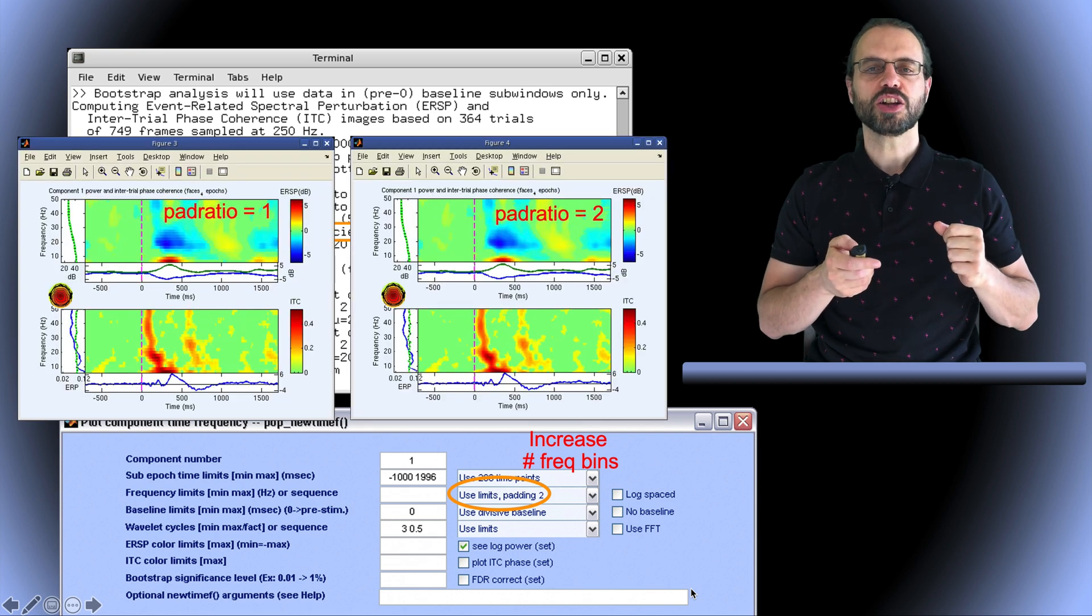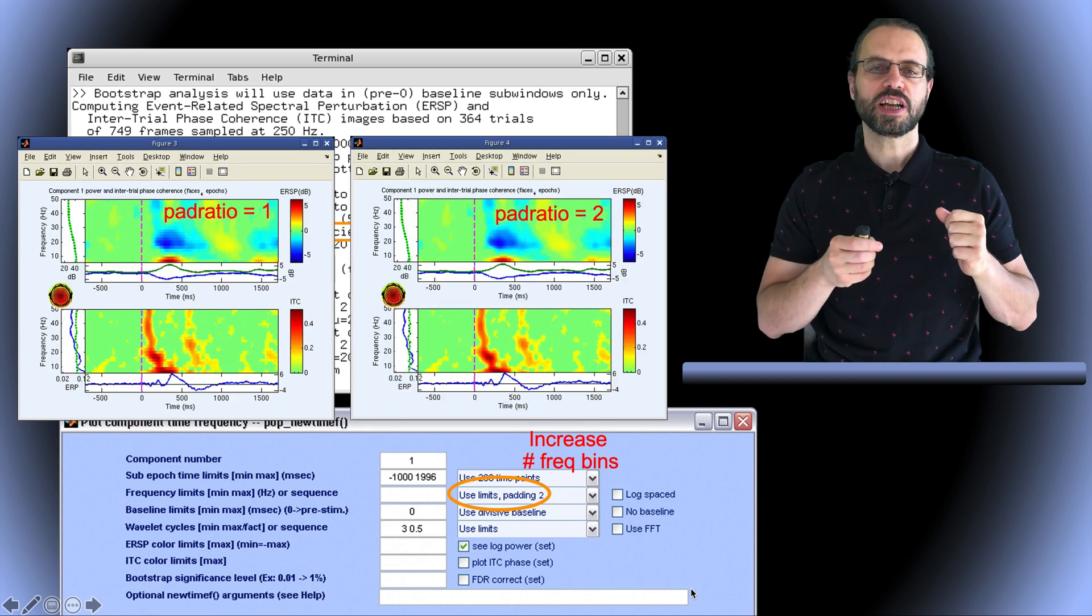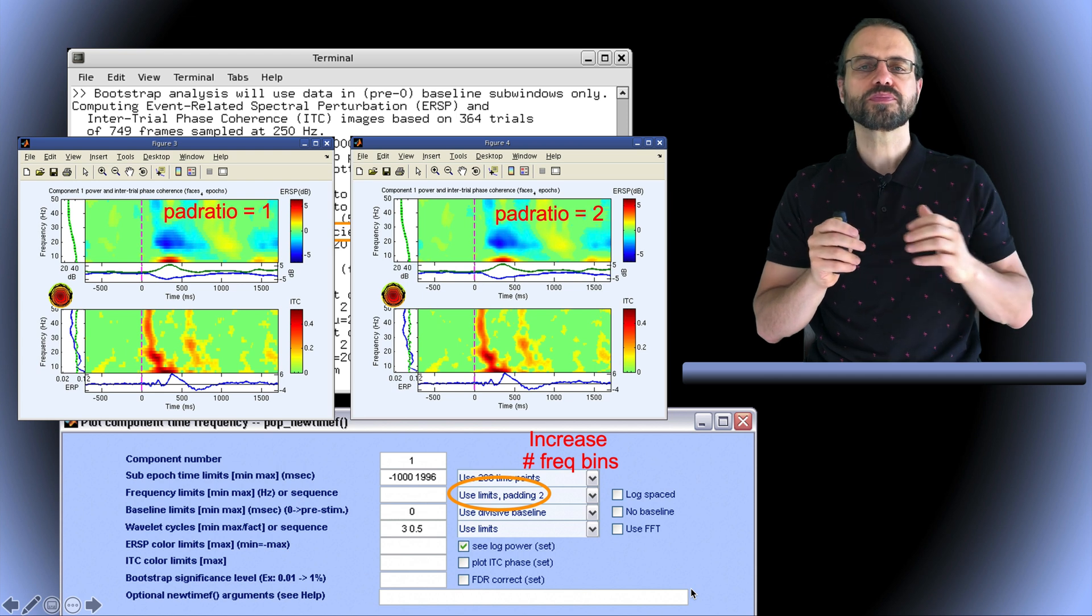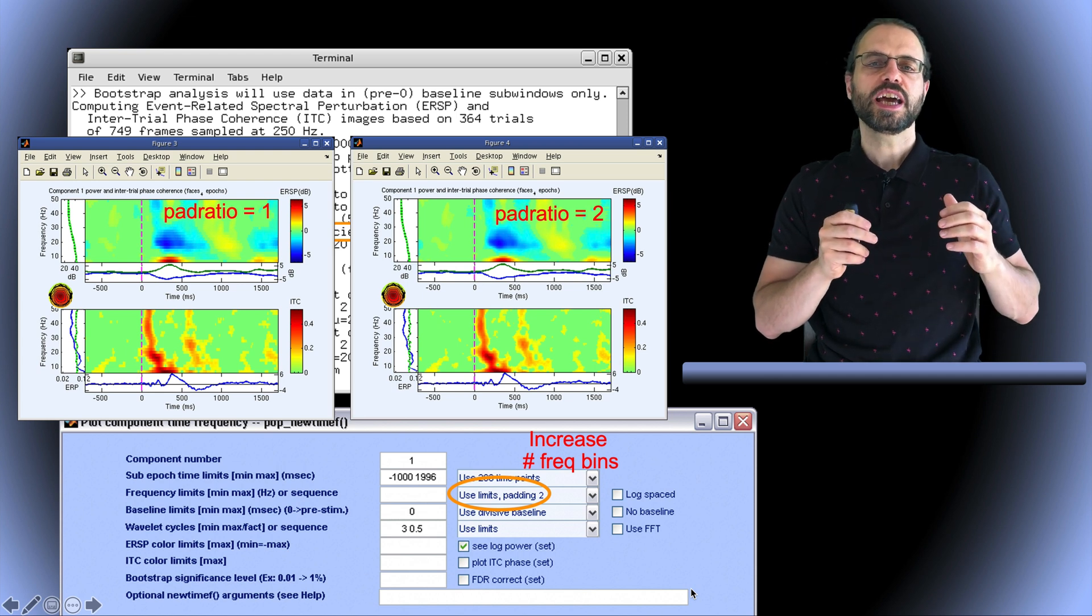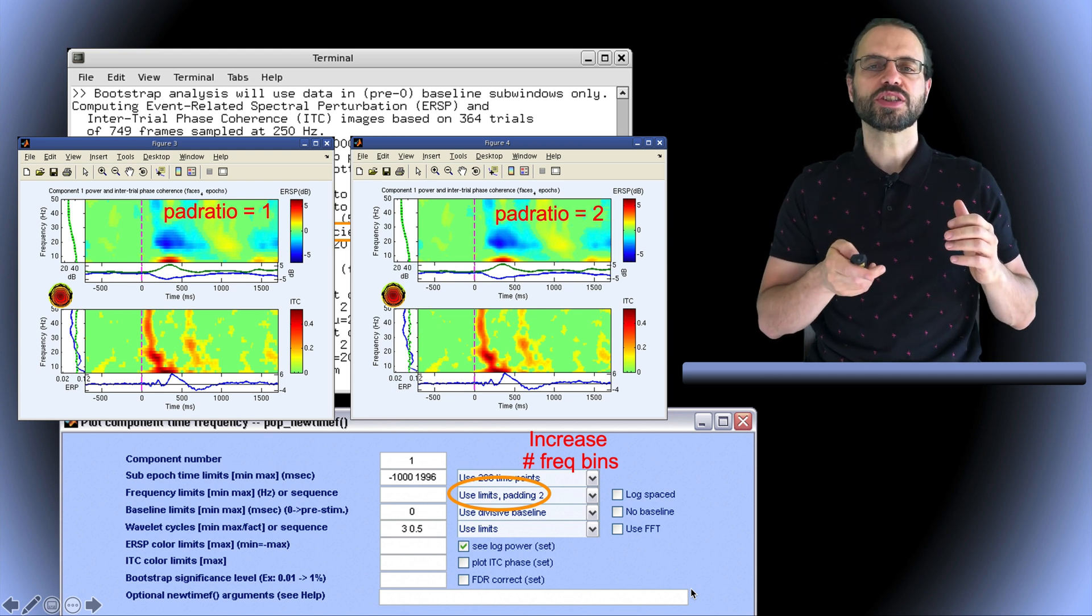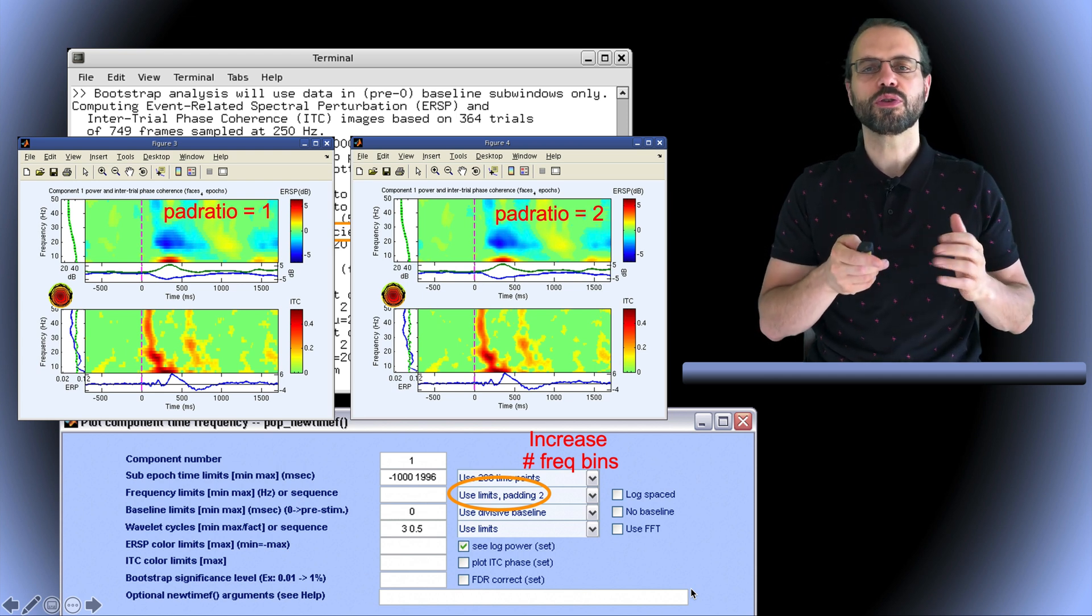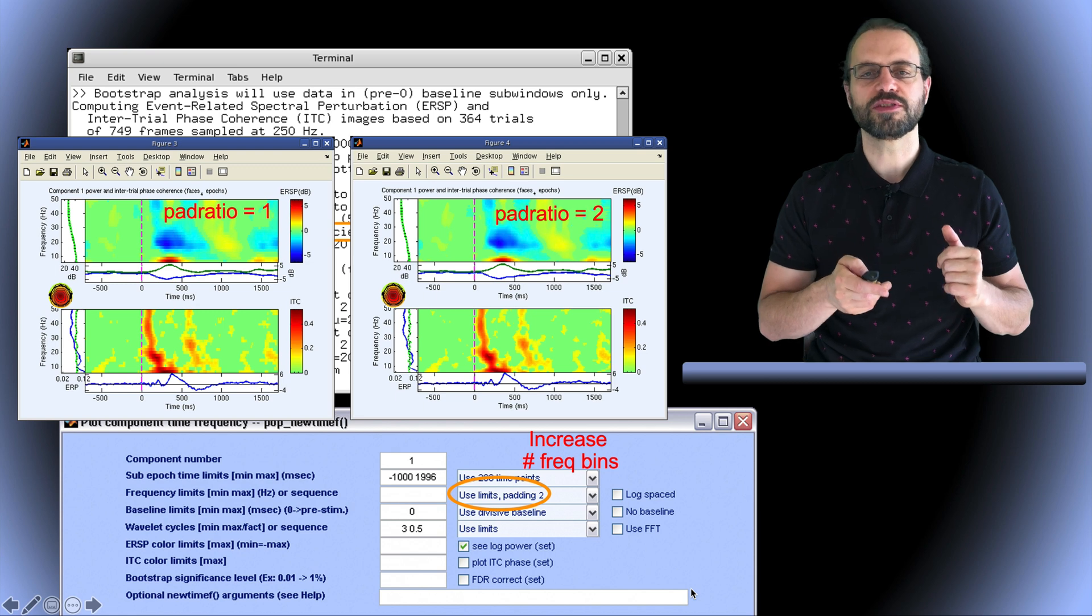This is how the plot looks like for a pad ratio of 1 and a pad ratio of 2. And you can see how the time frequency image is smoother on the right compared to the left.